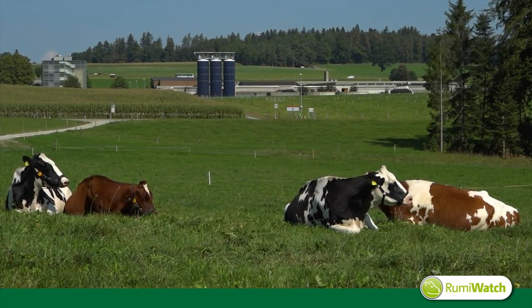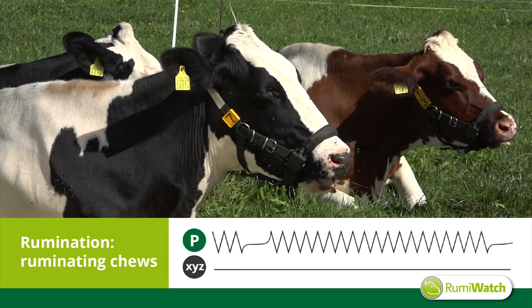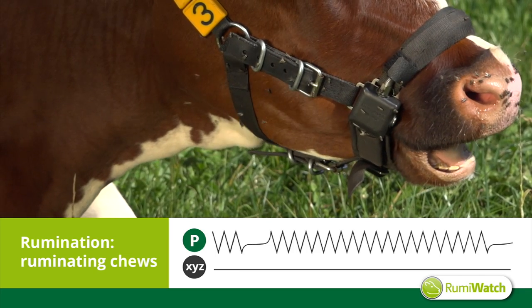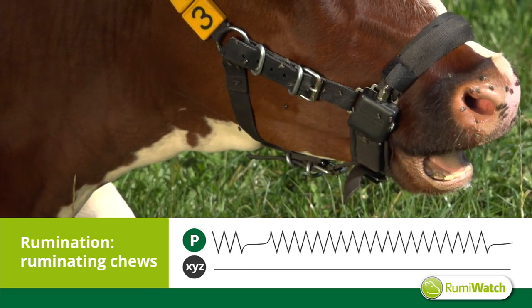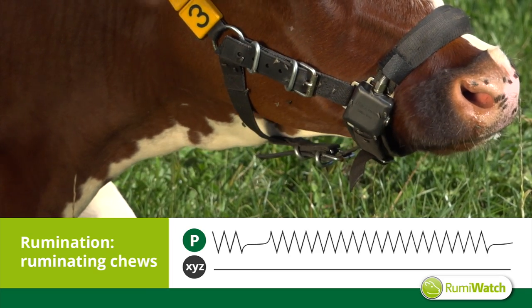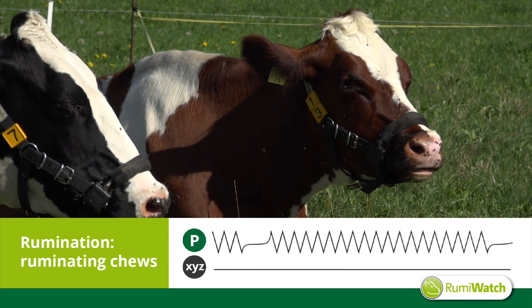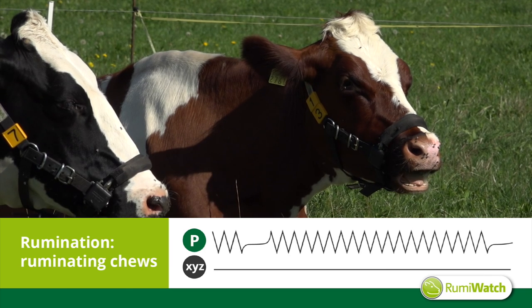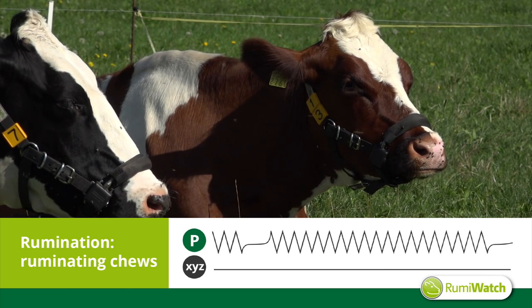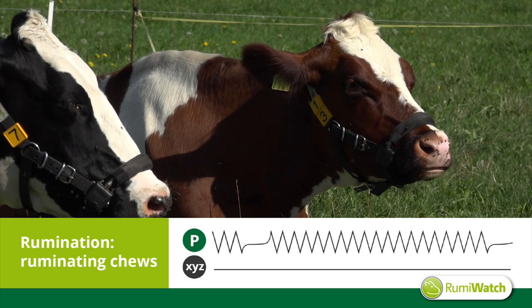During the rumination process, the jaw movements are totally different. The slow and rhythmic movements with disruptions for regurgitating a new bolus characterize the rumination behavior. You will recognize the steady peak profiles obtained from the pressure sensor and accelerometer. The peak profiles of the pressure sensor are interrupted consistently, which represents the regurgitation of a bolus.